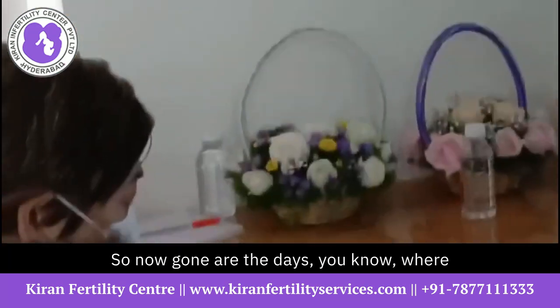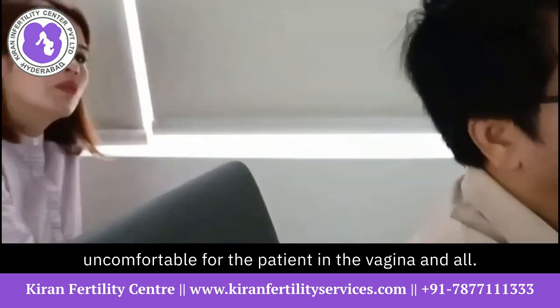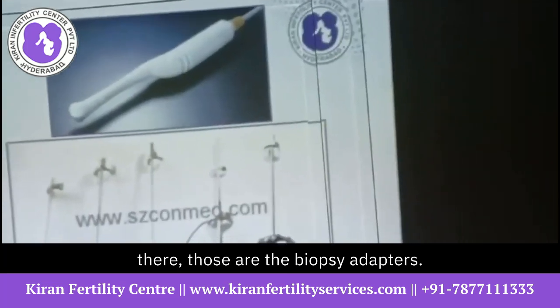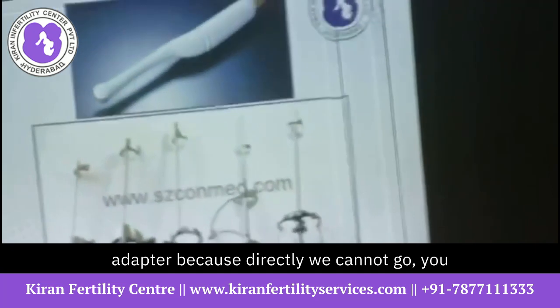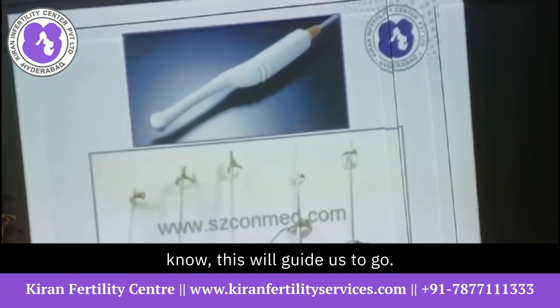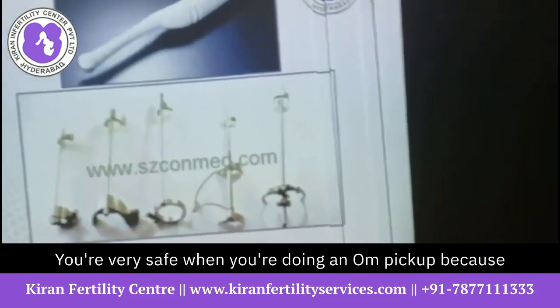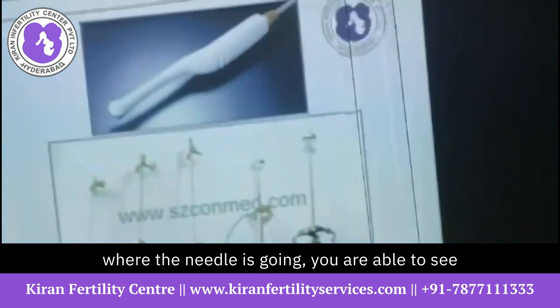Gone are the days where you have a very big probe which is very uncomfortable for the patient in the vagina. Now you have very sleek probes and very good frequency probes. Below what you see there are the biopsy adapters. You understand why we should have a biopsy adapter? Because directly we cannot go; this will guide us. The biopsy adapter gets fixed onto the probe, I will show you, and then the needle will pass through that. So you're very safe when you're doing an ovum pickup, because where the needle is going, you're able to see the needle.